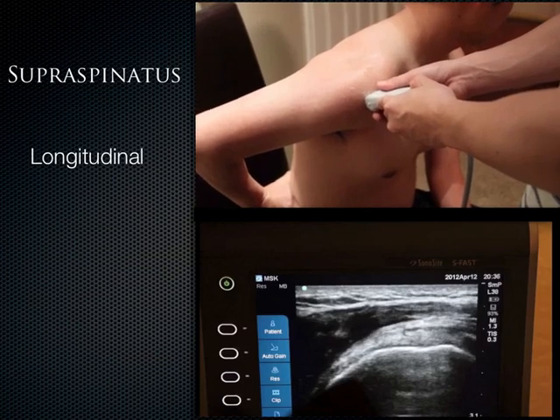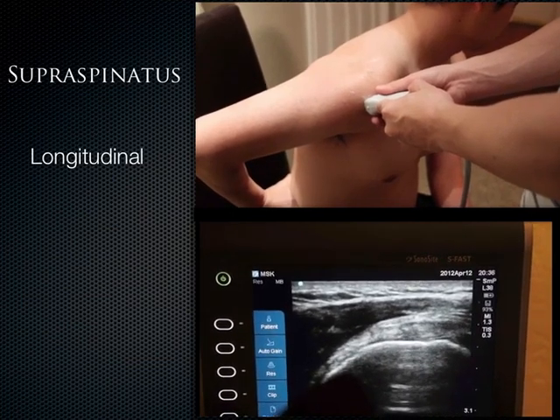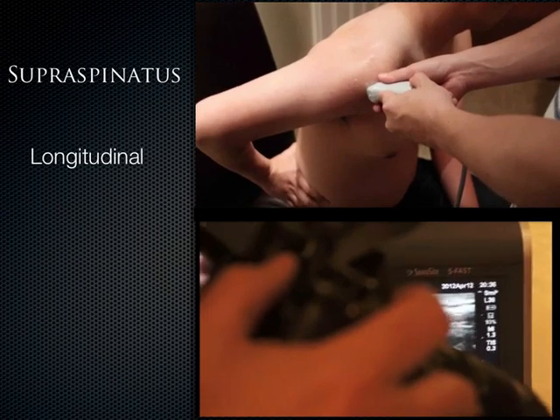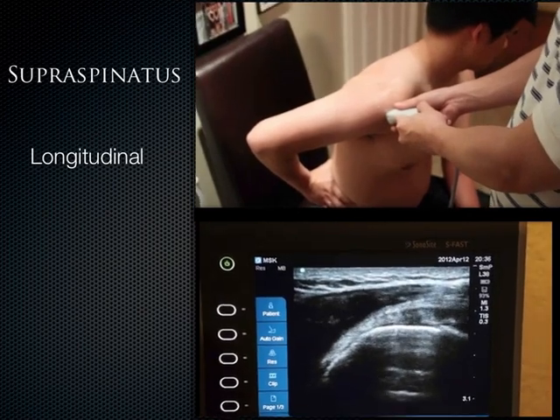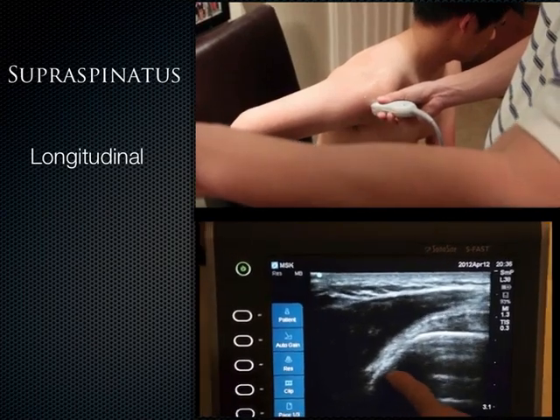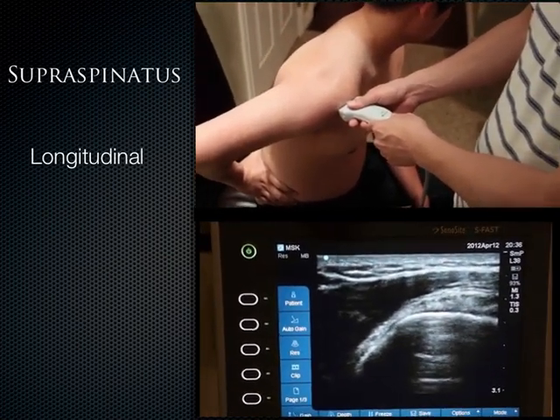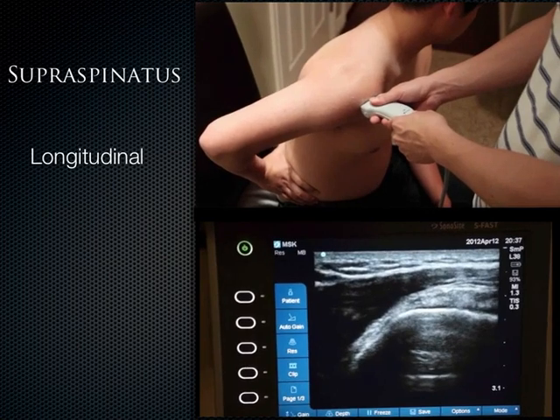In order to get the supraspinatus tendon at its insertion point at the greater tuberosity of the humeral head, I have to have the patient internally rotate and extend the shoulder so that the supraspinatus tendon drops into the anterior view. This is what I see on ultrasound. The supraspinatus tendon attaches right here at the greater tuberosity. This is also known as the critical zone because the vascular supply is not as good as at other points at the tendon insertion. So this is where you'll see a lot of pathology.